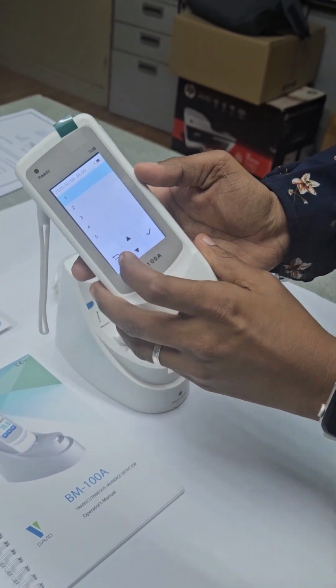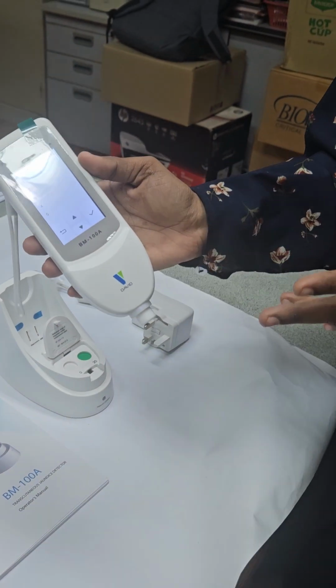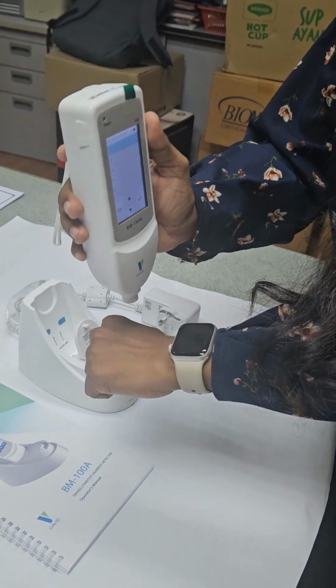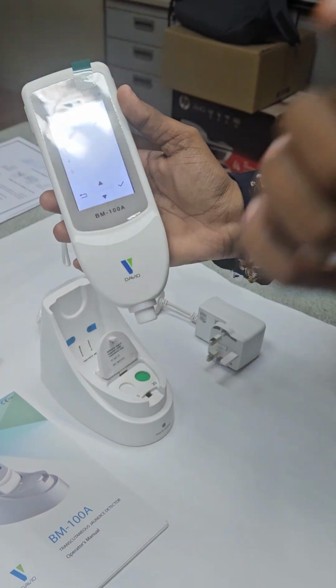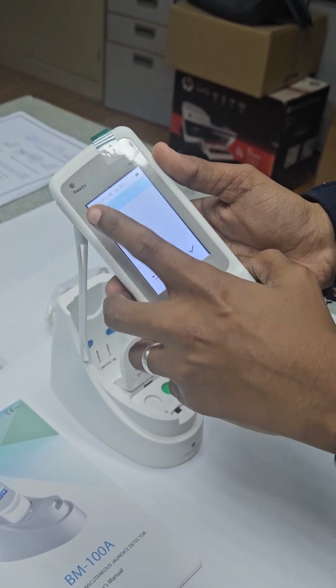Okay. Average. You can set the average from 1 to 5 times. So normally most of our users prefer 3 times. It means that we will take 3 readings, then they will get the range. Okay, so we can set how many readings we want.